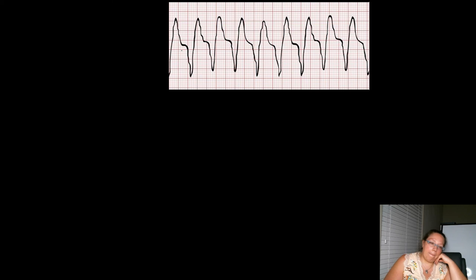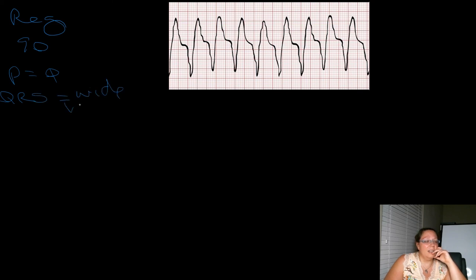All right. Are we regular? Yep, we're regular. What's the rate? 7, 8, 9, 90. Okay. Do we have P waves? No. Do we have QRSs? Yeah, we have some pretty funky looking ones. They're wide, they're bizarre. People love the word bizarre with cardiac. So we have a ventricular rhythm, right? Because all of our signals are coming from the ventricles.